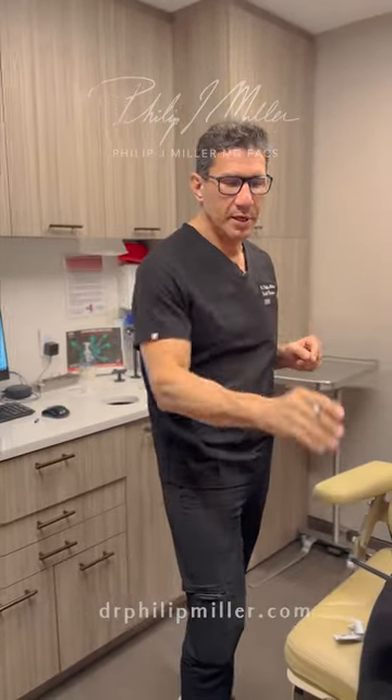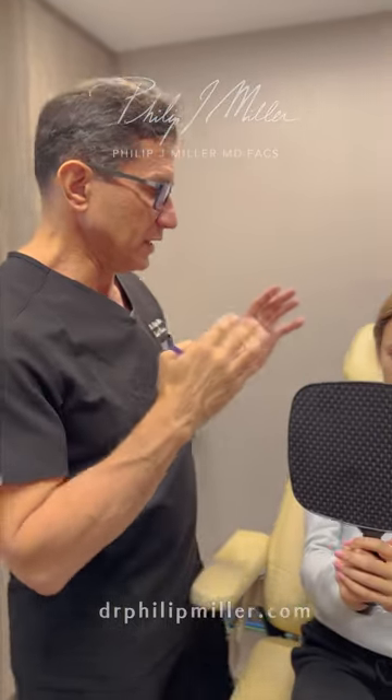It's Dr. Miller. We're going to show you step-by-step how to do the micro lift. The first thing we're going to do is have the patient hold the mirror and say what orientation or vector they like the lift.